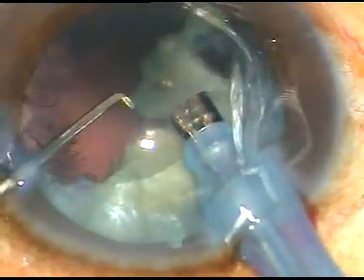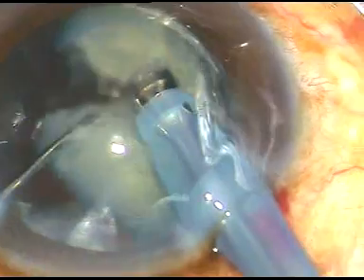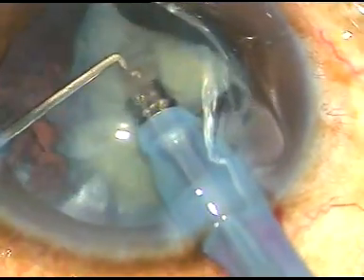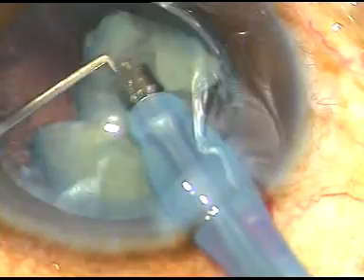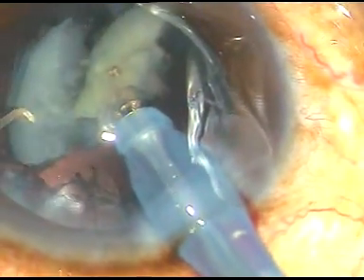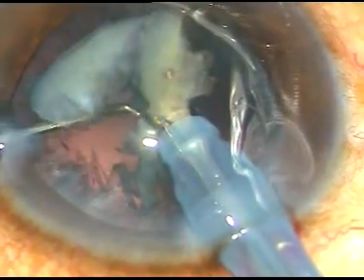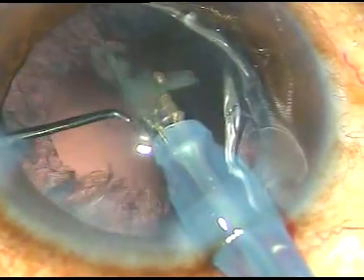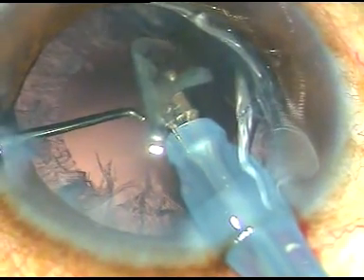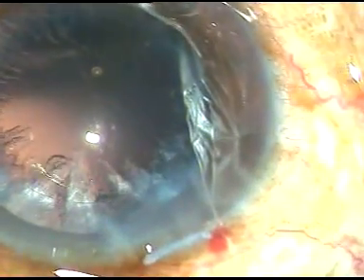One heminucleus has been removed by this time. Phaco power in this case is 55%, flow rate is 45, and vacuum is 450 millimeter of mercury. In this case, there was some amount of iris prolapse through the side port, so I didn't come out at this time, so I went behind the lens fragment and placed it like this so that if the posterior capsule comes, I can prevent it from being caught by the phaco tip.